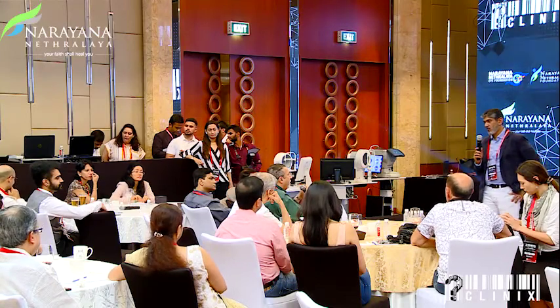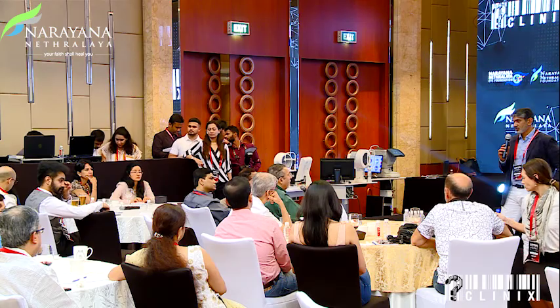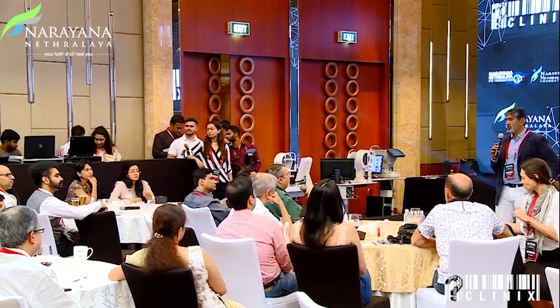If there is no astigmatism, is there a refractive power cutoff beyond which you will go for an ICL and below which you will go for a laser? See, in all cases of abnormal topography or very thin corneas, I prefer an ICL. I've done an ICL even for 2.5 diopters. Keratoconus, early keratoconus, stable keratoconus.